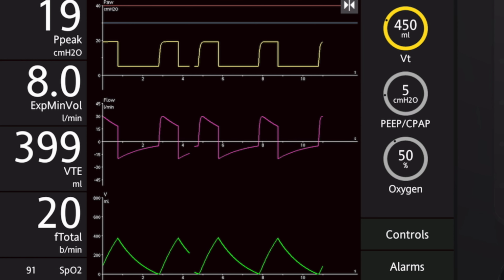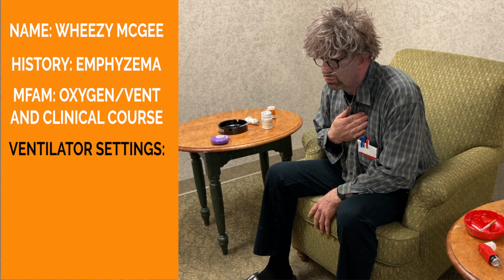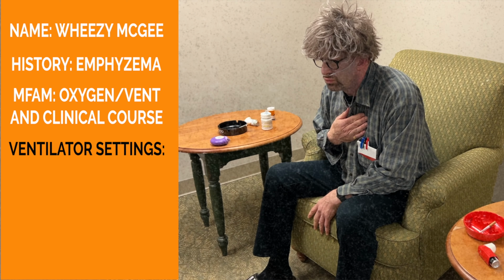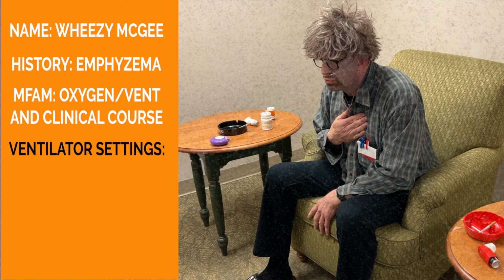Suppose the expiratory branch of the flow waveform does not return to the zero flow line before the next breath. It indicates breath stacking, a harmful and potentially lethal condition we must correct. Here is a patient with emphysema, Wheezy McGee, intubated for failure of oxygenation and ventilation, and his anticipated clinical course.